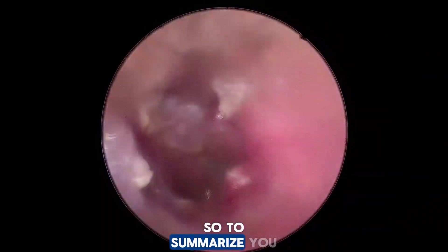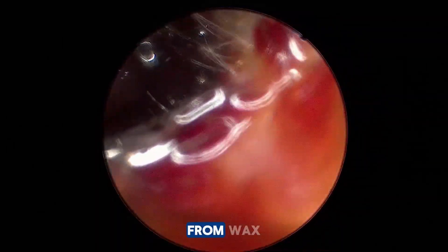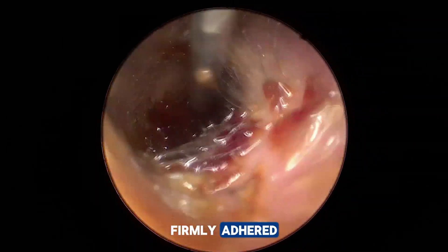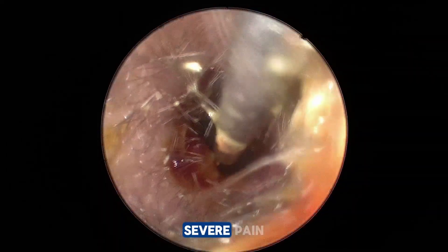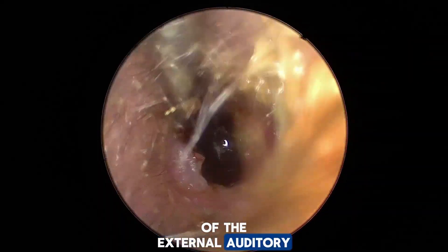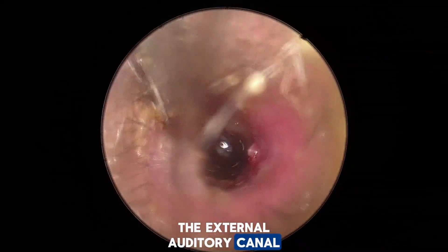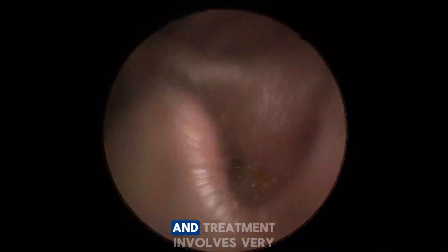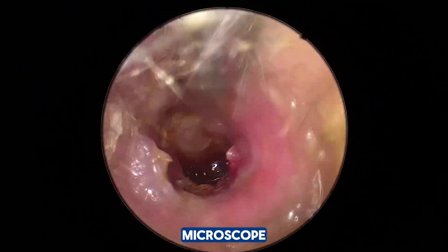To summarize: keratosis obturans is absolutely different from wax. It is composed of keratin and is very firmly adhered compared to ear wax. It causes severe pain and widening of the external auditory canal — which is not seen in impacted wax. Treatment involves very careful removal of debris under endoscopic guidance or microscope.